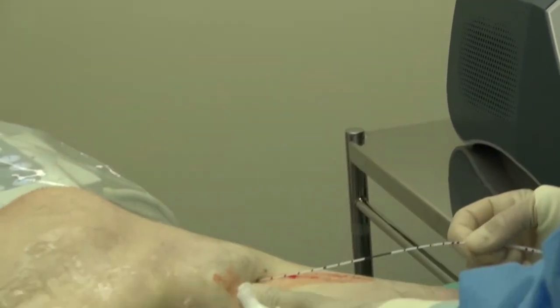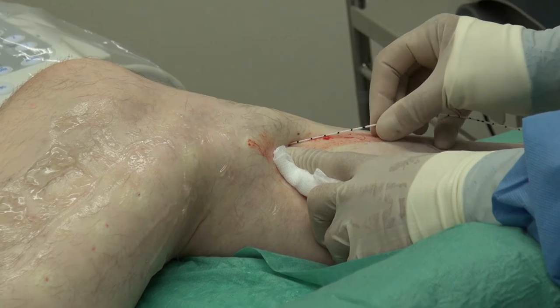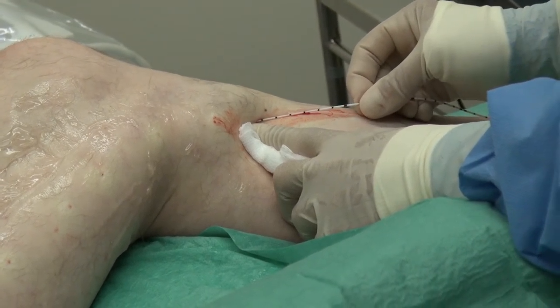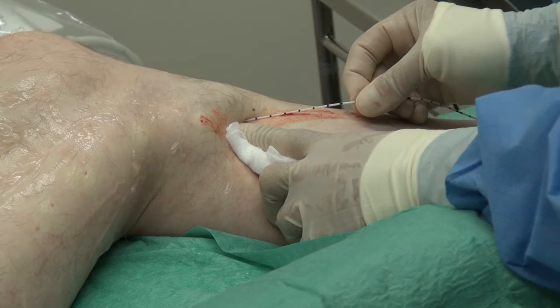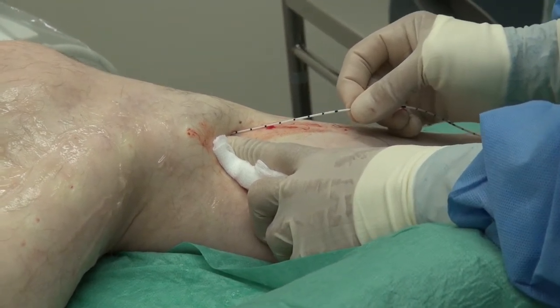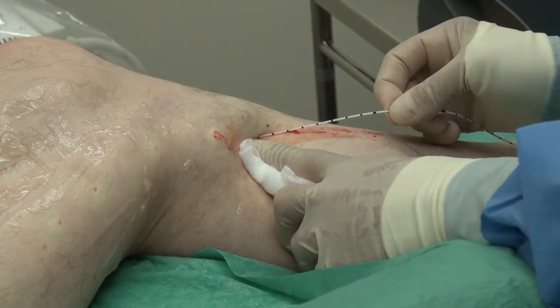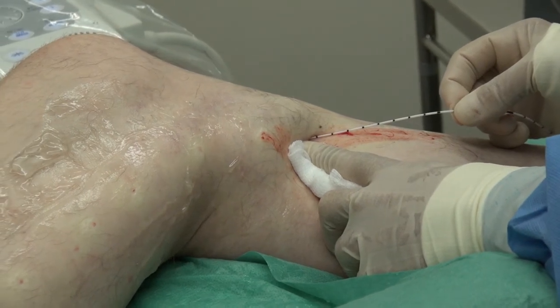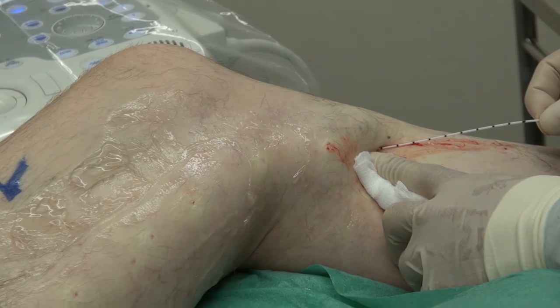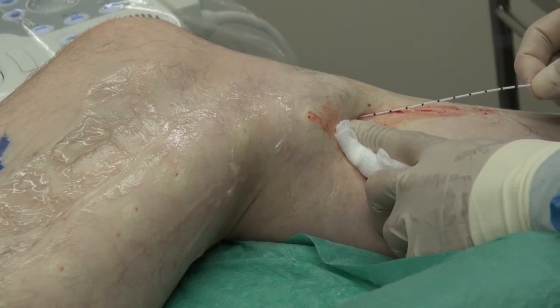At that point, we will take off our laser goggles and the procedure will be complete. So far, this procedure has taken just over 30 minutes — somewhat slower than we would normally do because I've been talking and demonstrating. But as you can see, in real time it's about 30 minutes.